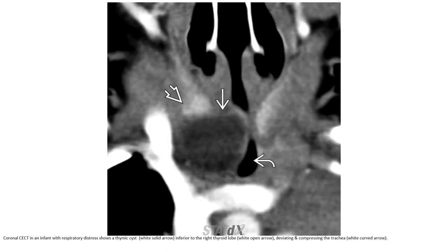Contrast-enhanced CT in an infant with respiratory distress shows a cystic mass inferior to the right thyroid lobe, elevating and compressing the trachea.